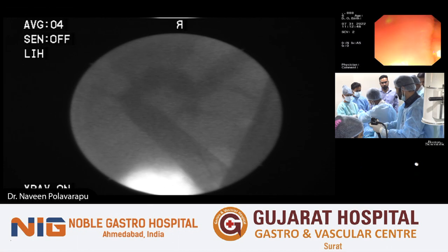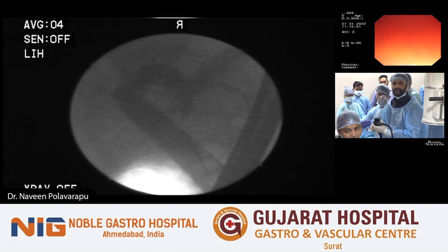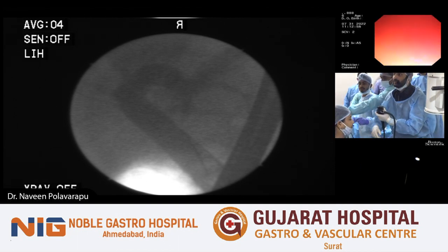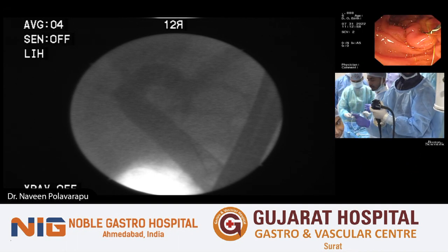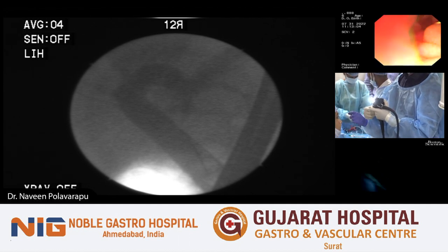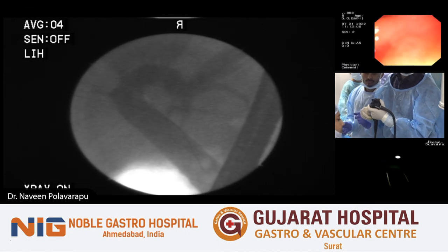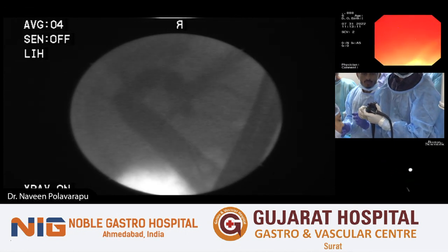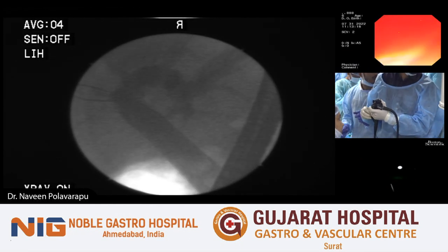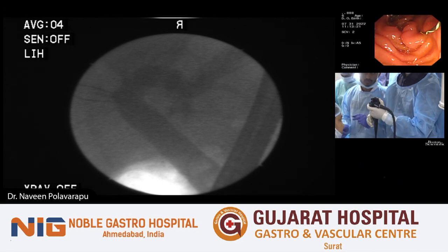I think we've got a good assistant here who is able to do it very quickly. So any questions or any suggestions looking at the cholangiogram? Let's screen once, I just want to check the wire. How far is it? Okay, it has gone up. We'll just get this out. I think it curled out. Wire probably curled up, but anyway, we are above the stone, we should be able to get through.